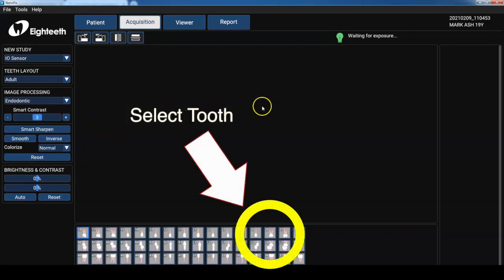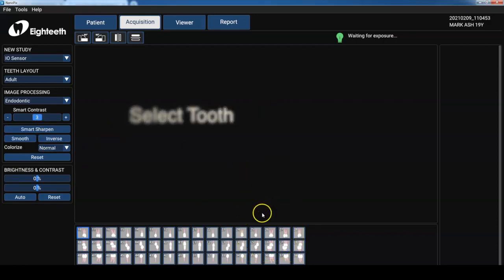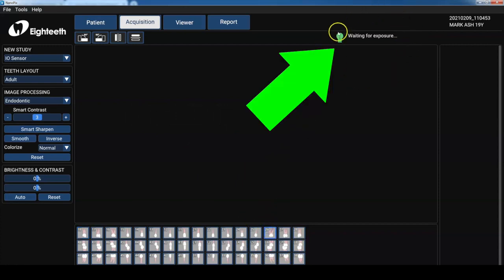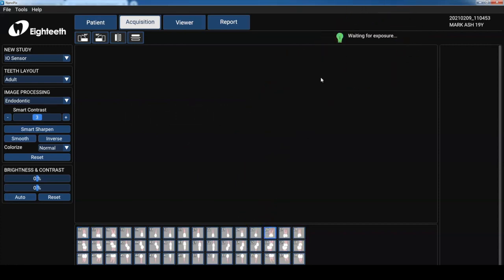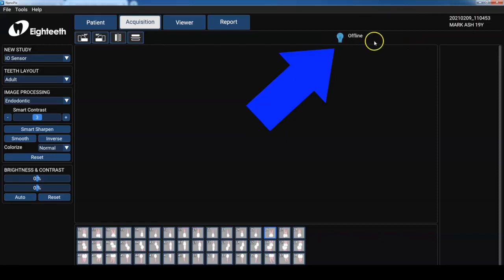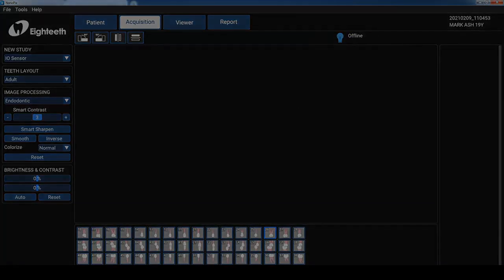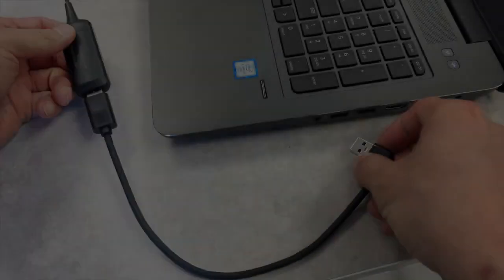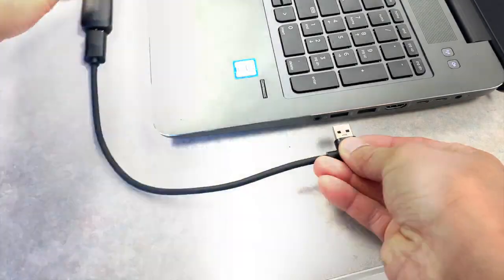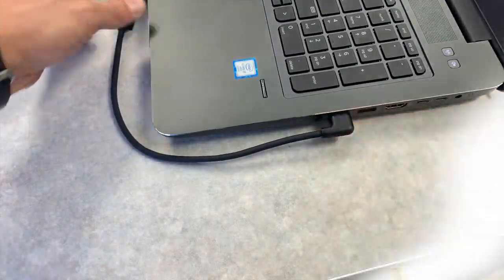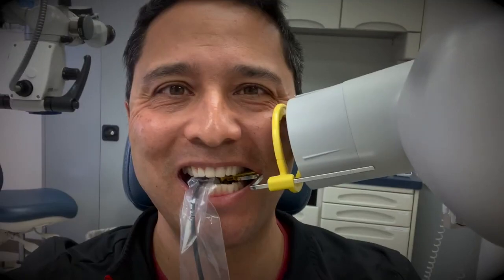Now we're going to take a radiograph on me, tooth number two six. The beauty of this program is that it's always ready for exposure. So you can see here it's waiting and ready. But if you see the blue it means that your sensor is disconnected and you need to reconnect it. Let's connect up our sensor and take an x-ray on a patient. That'll be me.